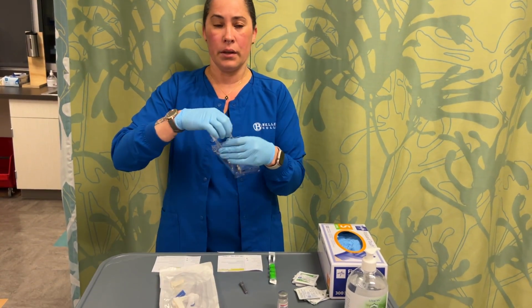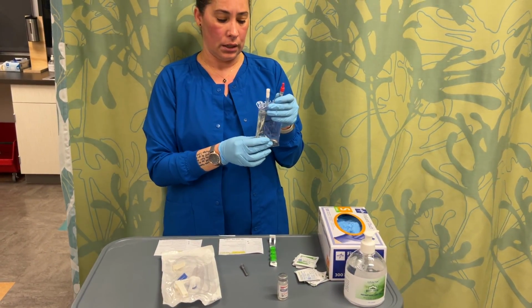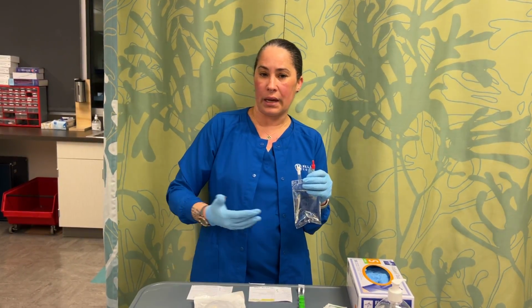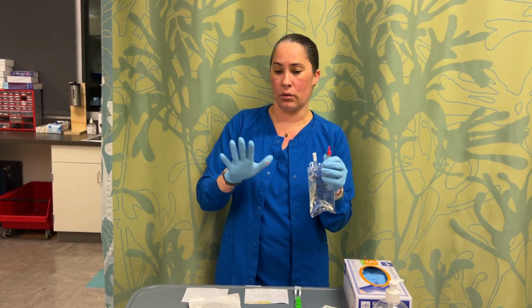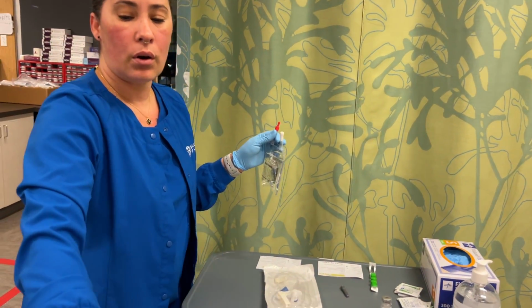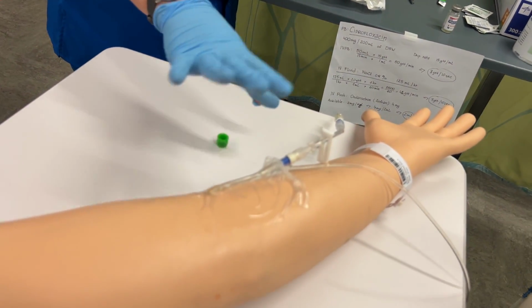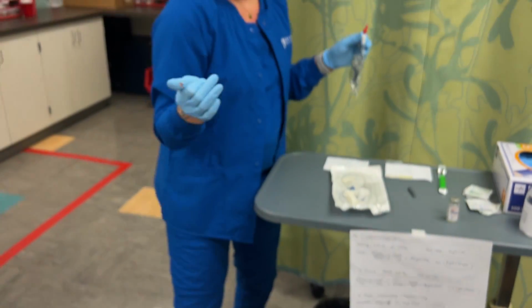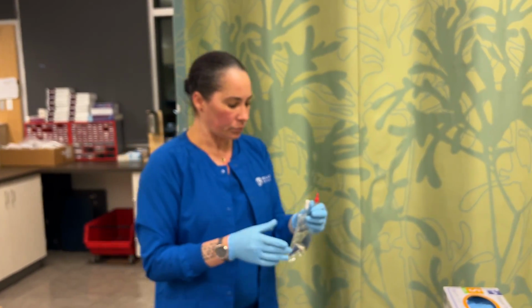So our next thing is going to be our antibiotic. With this antibiotic, again, we've explained to the patient what to expect, and we're going to want to make sure that they're going to tell us what's going on. Also, again, you're going to want to always look at the site. You want to make sure that there's no infiltration, everything looks good, clean, dry, and intact. Super important. Always check the site.